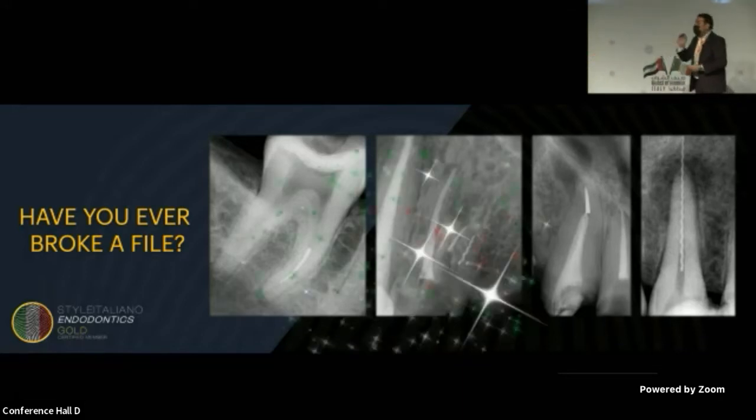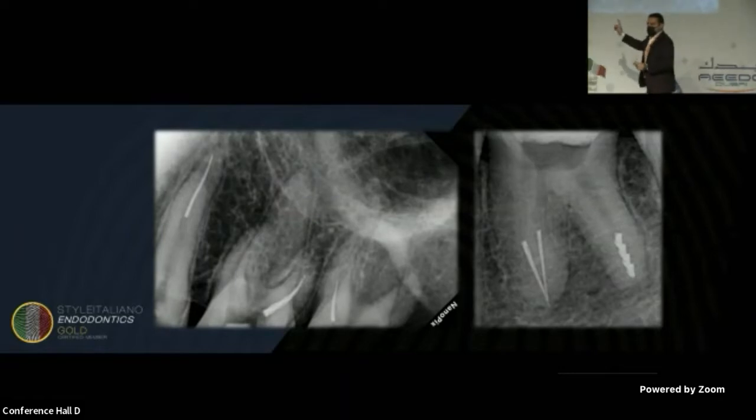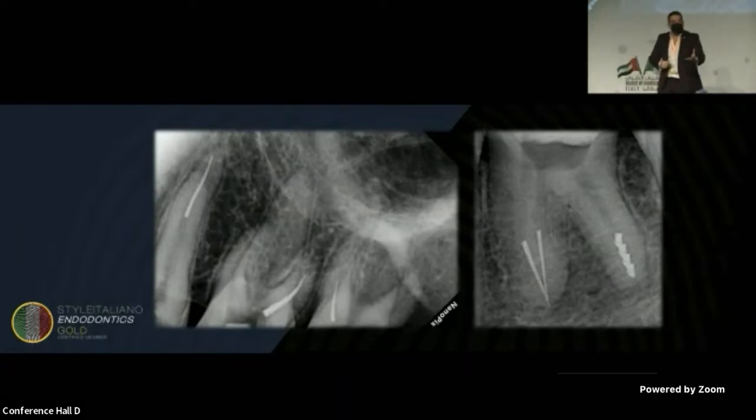But imagine you're doing three root canal treatments for a patient, and in each tooth you're separating a file. You're doing root canal treatment for a molar like this, and in each canal you're separating a file. So you don't need to learn how to manage separated instruments. You need to learn how to prevent instrument separation before learning how to manage, right?